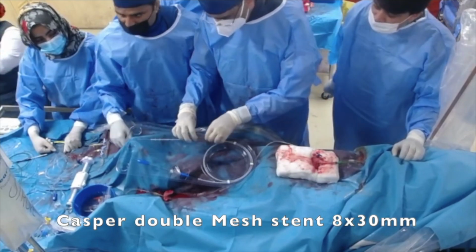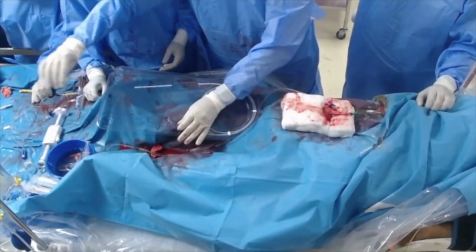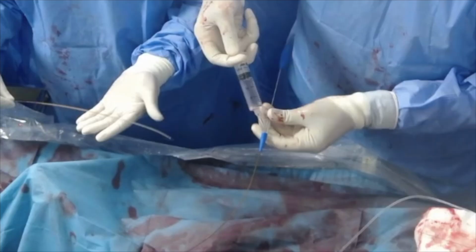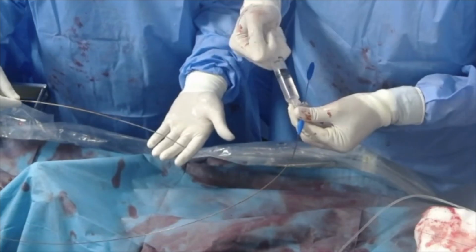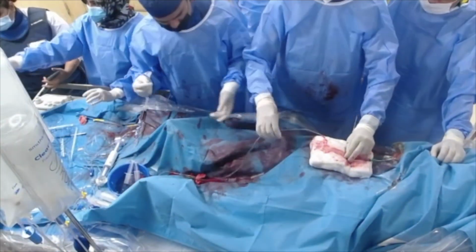I decided to take a Casper, which is a closed cell design stent with a double mesh. But before that, through the NG tube, we gave the patient 600 milligrams of clopidogrel and 300 milligrams of aspirin as a loading dose.